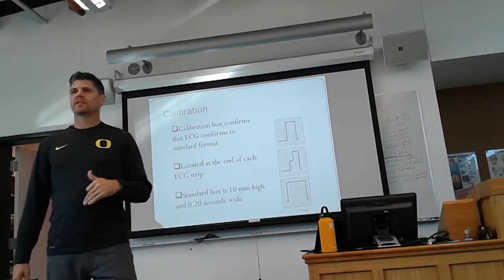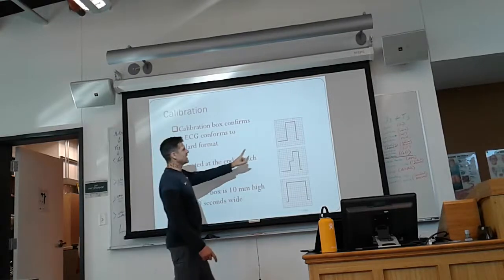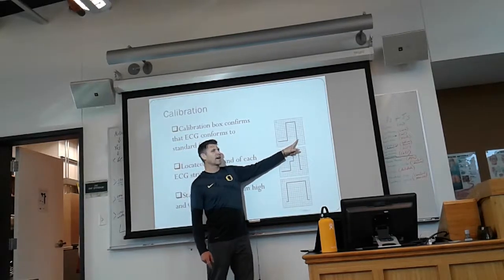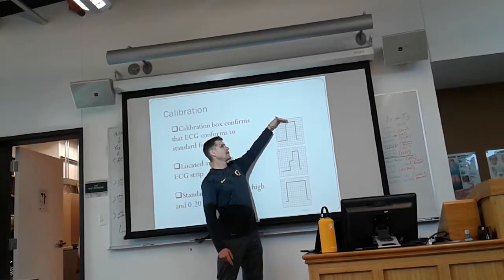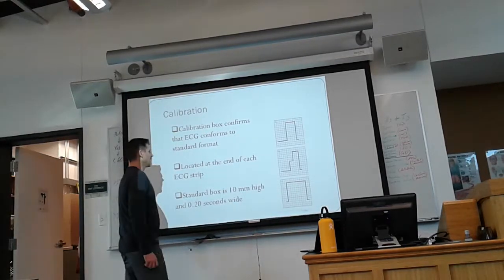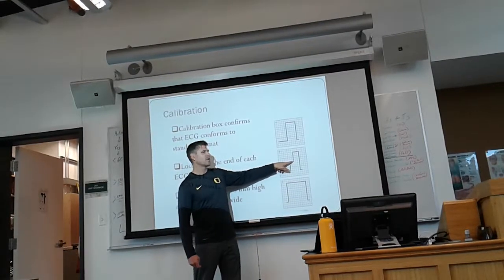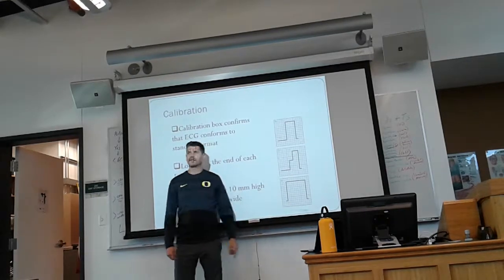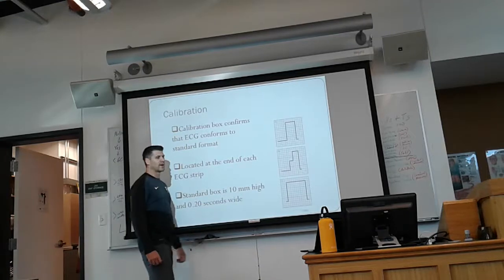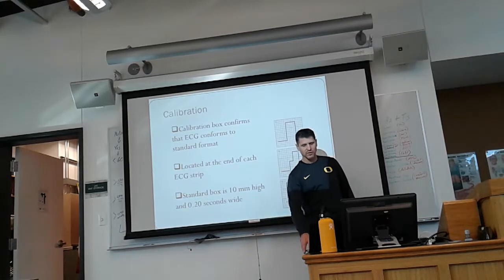We can change that calibration within a given patient if we need to see some things. So you'll either see the standard calibration, which is a rectangle that is exactly 0.2 seconds in time on the x-axis and 10 millimeters on the y-axis. So it's twice as high as it is wide. Sometimes we will see a slight difference in the calibration, where we'll see a notch halfway through the calibration box, or the box being twice as long in terms of time but the same height. Those are calibration differences that we sometimes plug in so we can more adequately see what the patient is actually doing.